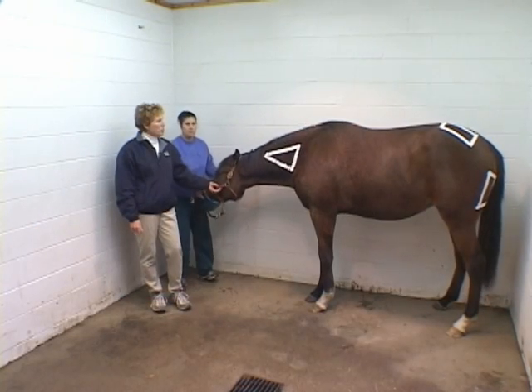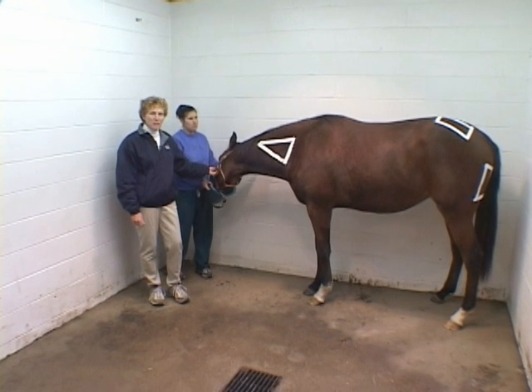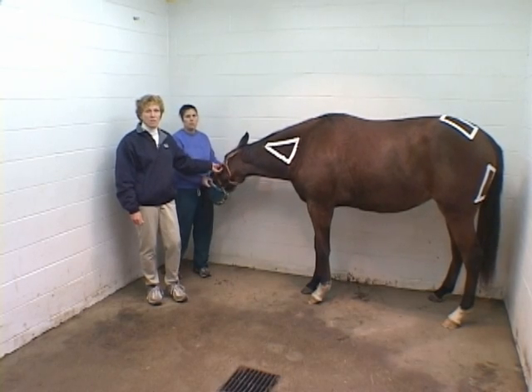We've put one-inch adhesive tape on this filly to demonstrate where anatomically you'd be placing an intramuscular injection. I want to go over the major sites and then discuss some of the pros and cons of each site with you.